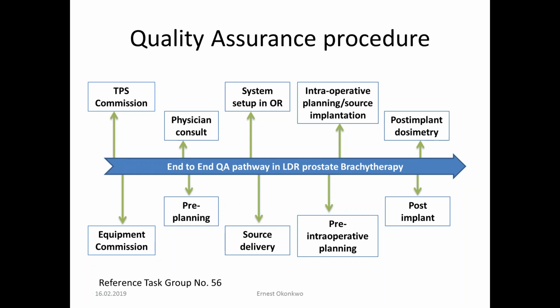So you have to make sure that the environment is left not contaminated in any way. And then you have the post-implant dosimetry.